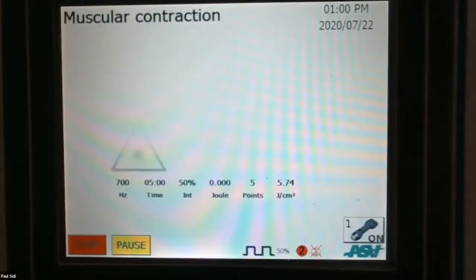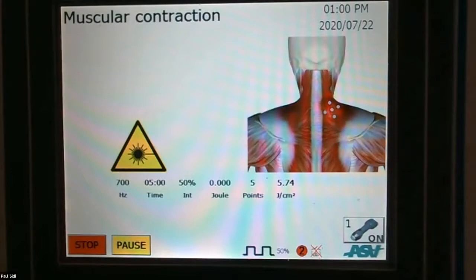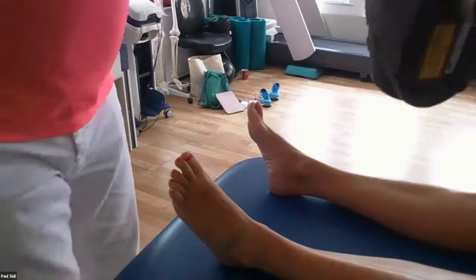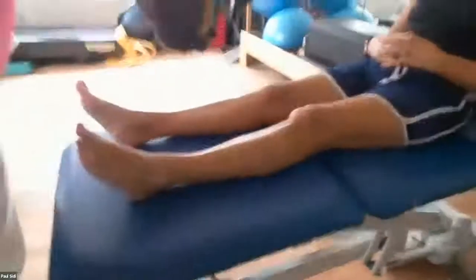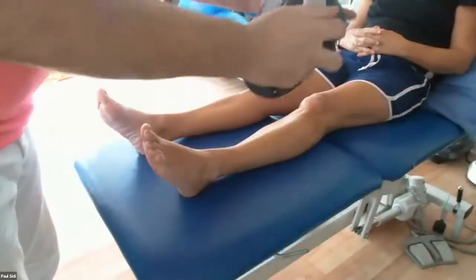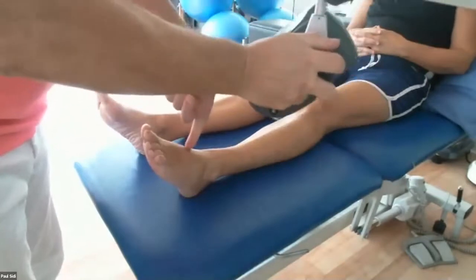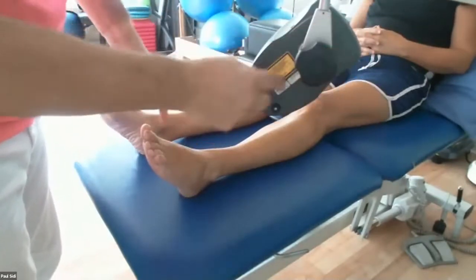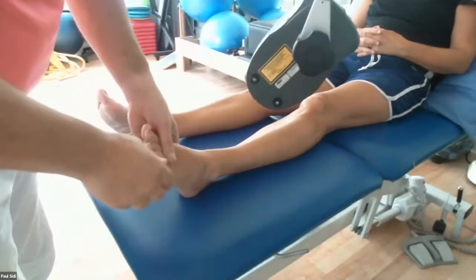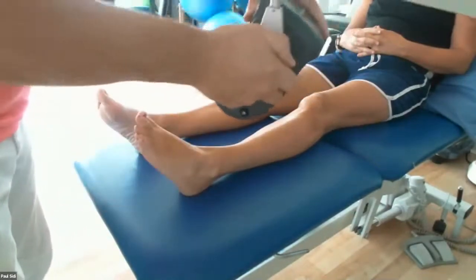Right, get your glasses on. Change the thing over here. That one. Okay, right, now, same old thing. Could I get you to, I'll bring the chair head down here. How far should it be away? It should be that far away, okay? So having the metal, you've got a metal thing which sticks in, which I don't like, okay? I'm going to put it over the midfoot there. Remember what I said? Optical window. Let's keep that there. Let's get that round there.